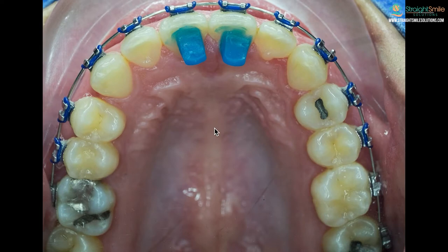Sometimes you're going to have your bite bumps on your front teeth, sometimes on your back teeth — they may be on the top or the bottom, you might even get them on your canines. It really depends on the personal preference of the doctor and what they're trying to accomplish with them.